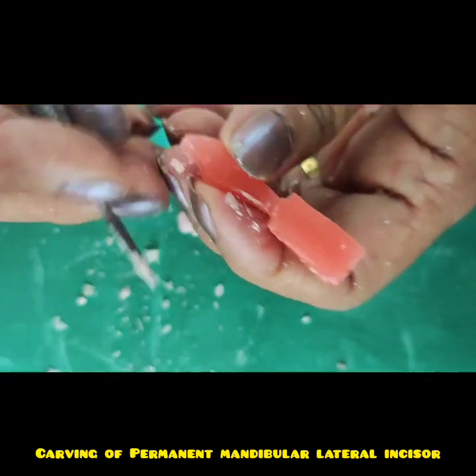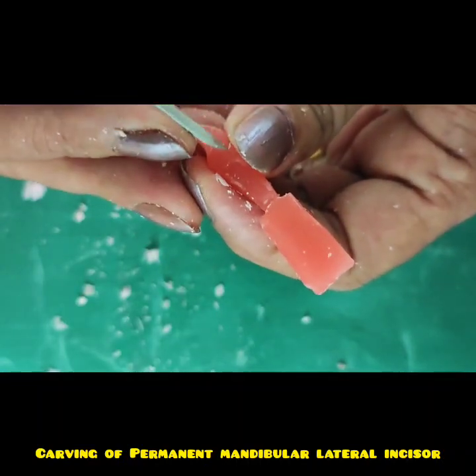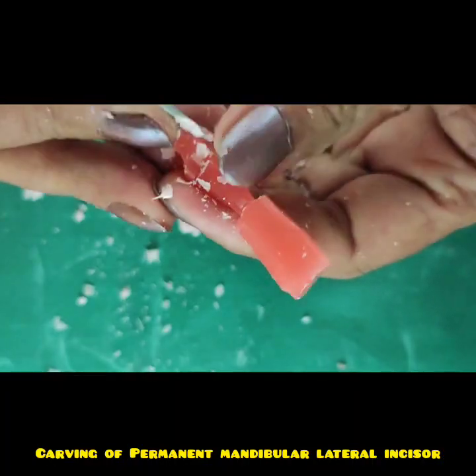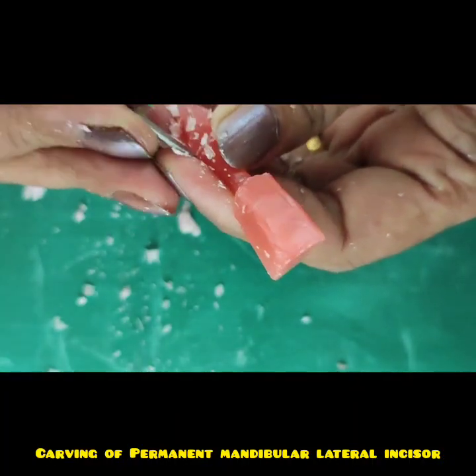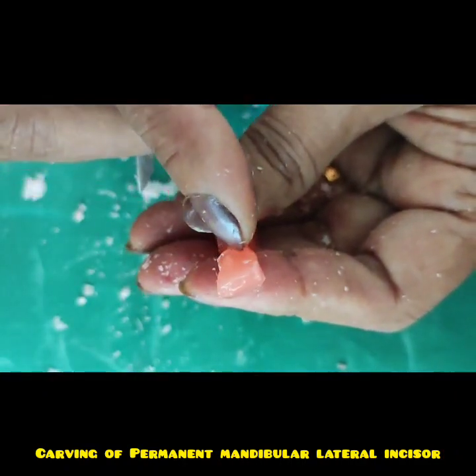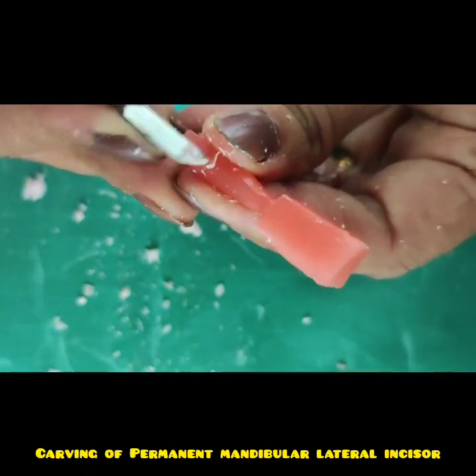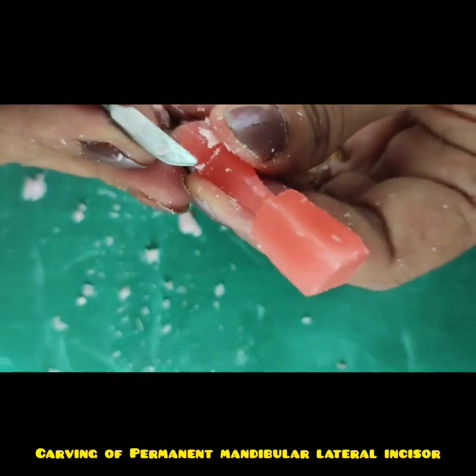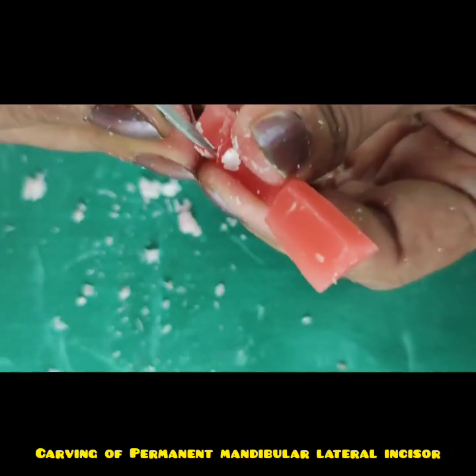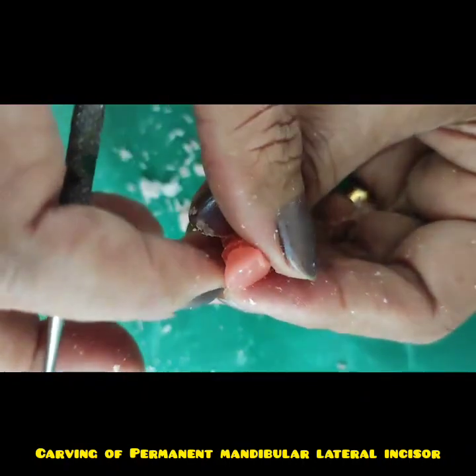Now the proximal reduction. I will use one of the line angles of the straight end of the carver, and I will move my carver from here to here, from the labial surface towards the cingulum, like this, so that if you see from the top, I have created a convergence. Similarly I will reduce from here, so I will keep it horizontally, and I will move my carver, and then join both the contours so that you will get a converging cingulum.